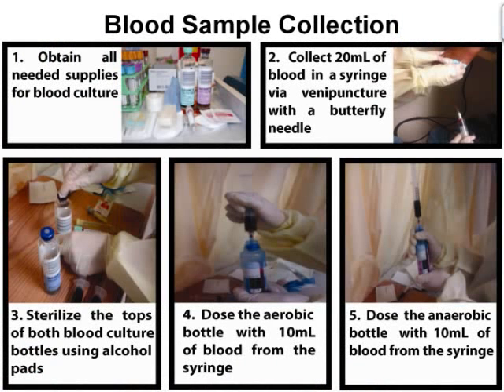The blood culture collection process performed at the bedside is described here. First things first, all necessary supplies should be compiled. For example, alcohol pads, butterfly needle and syringe, adapter, and the desired media bottles, which as stated before are typically the standard aerobic and anaerobic bottles.